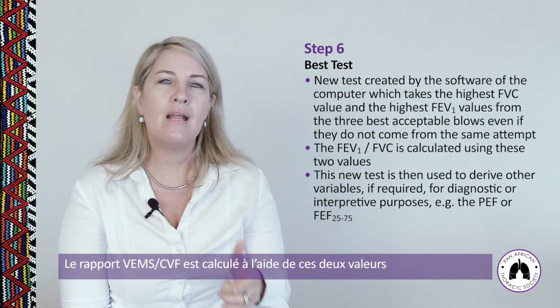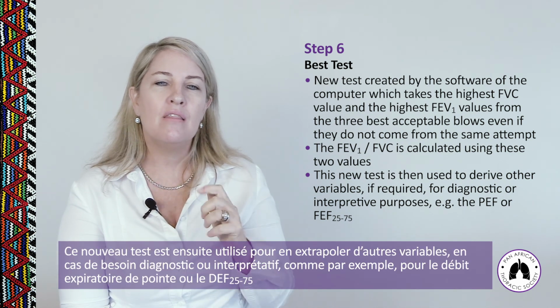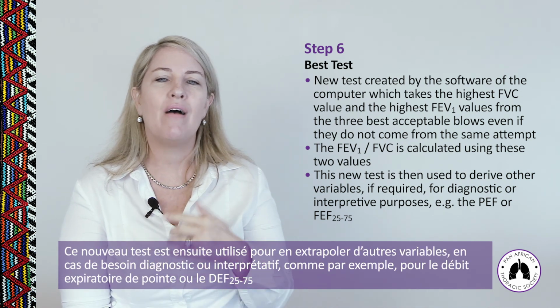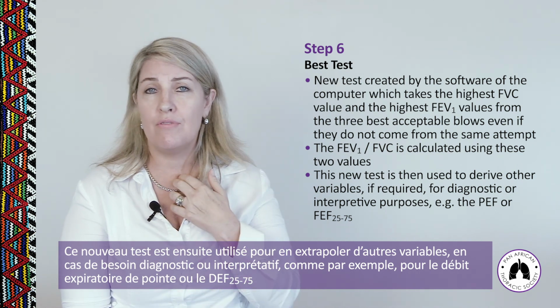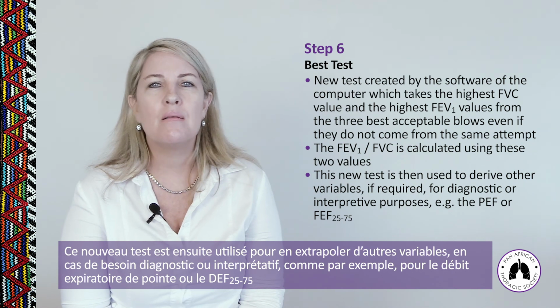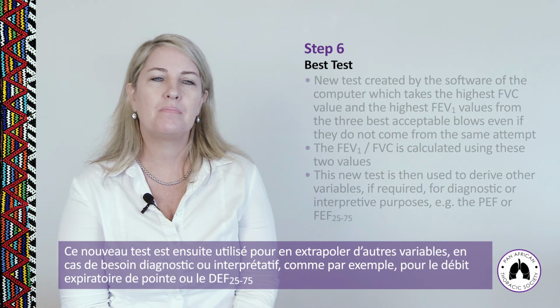The FEV1/FVC is then calculated using these 2 values. This new test is then used to derive other variables if required for diagnostic or interpretive purposes, for example, using the peak expiratory flow and the FEF 25 to 75%.